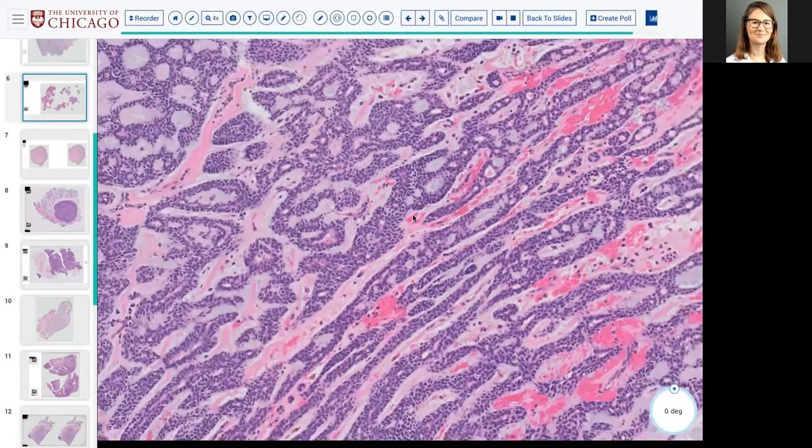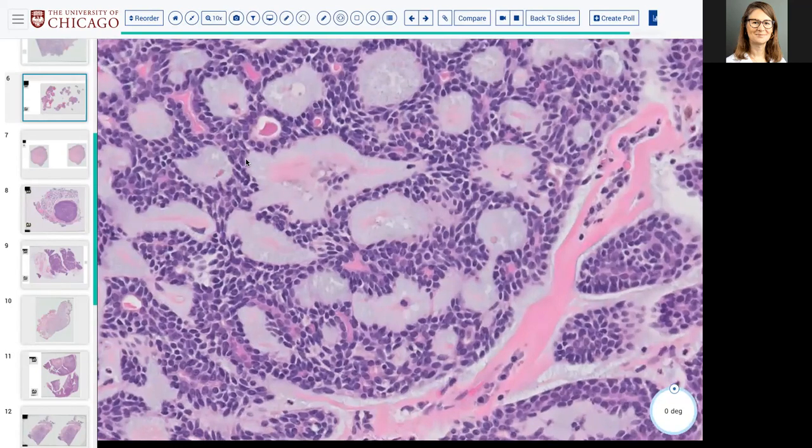Depending on whether the myoepithelial cells are adjacent to the stroma here or adjacent to the stroma here, they're secreting this bluish mucin both into the center of these nests and out at the periphery of these nests, because they are essentially sandwiching the epithelial cells. So if this is a nest of epithelial cells here and here, they tend to have more of a duct-like picture with this eosinophilic material in the middle, as opposed to the myoepithelial cells, which are at the periphery out here and are secreting the mucin here and here and here. Does that all make sense?